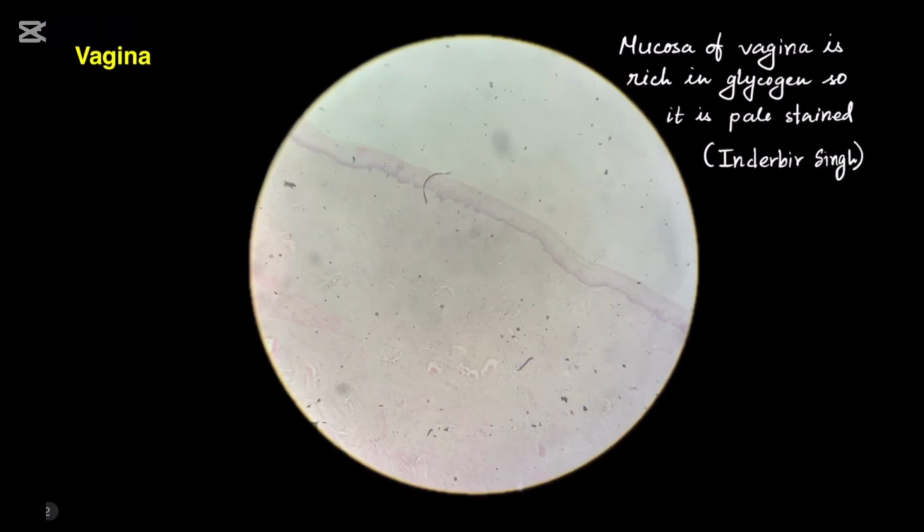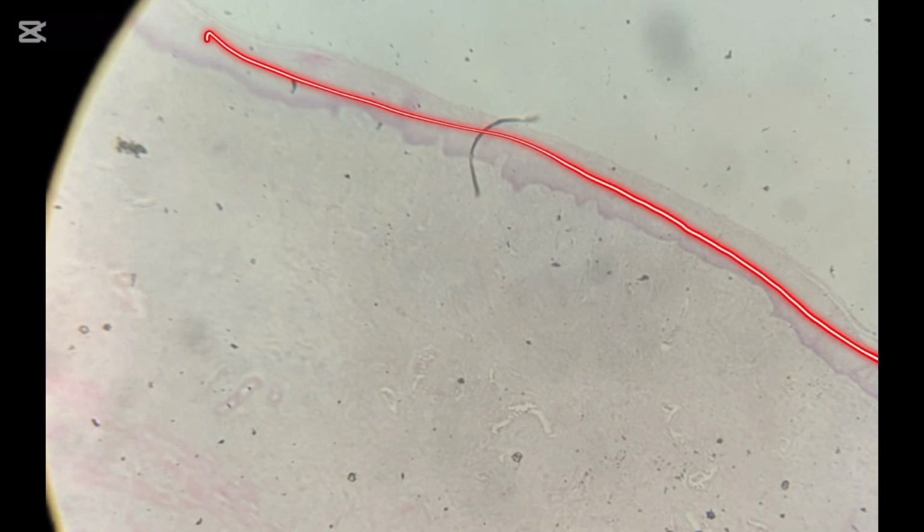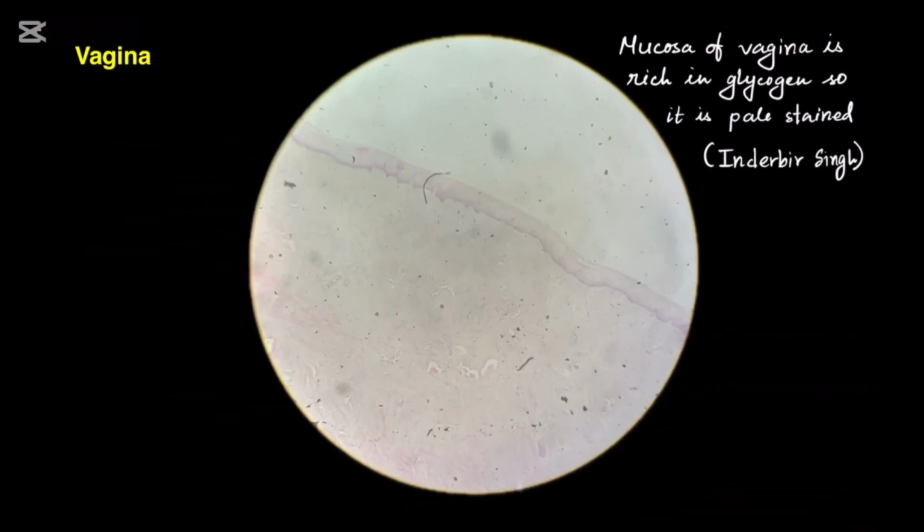So you can look at the histology itself. There's the non-keratinized stratified squamous epithelium, and the mucosa, you can see it is very pale stained. This is a line directly from Inderbir Singh. Mucosa of the vagina is rich in glycogen, so it is pale stained, and that is how you can differentiate the vagina from the esophagus.